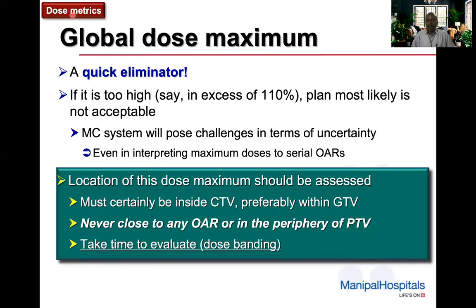The evaluation starts by looking at different dose metrics. First, I look at the global dose maximum, because it happens to be a quick eliminator. If it is too high — say in excess of 110% — then the plan most likely is not going to be acceptable.